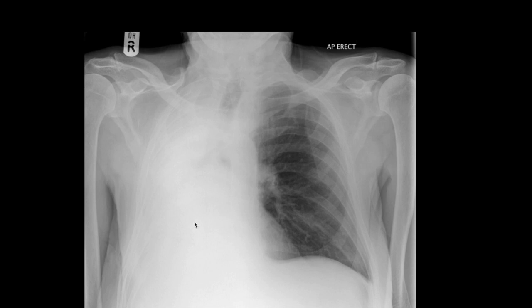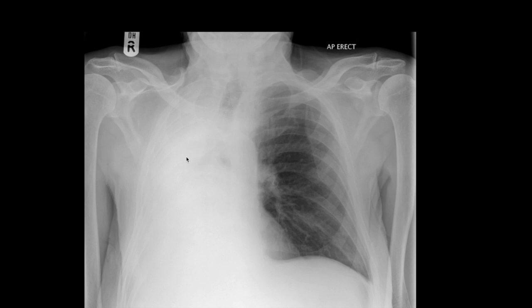Now we're going to switch pathologies. There's no air in the right hemithorax, no lung markings — so you're dealing with airspace disease — and you notice the trachea is pulled to that side. When the trachea is pulled toward the side of pathology, you have volume loss. What has happened is collapse of the entire right lung. On the left side you see normal lung markings and air; on the right, there's no air and volume loss — this is collapse of the right lung.